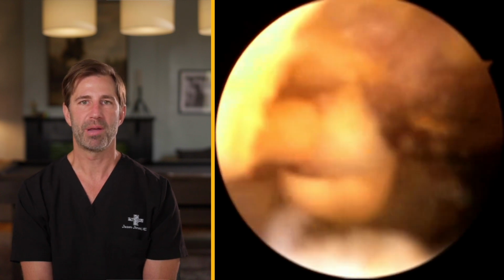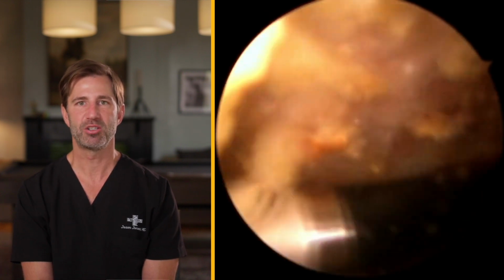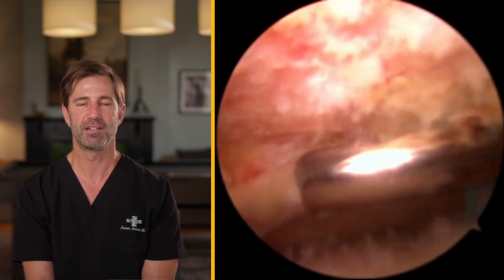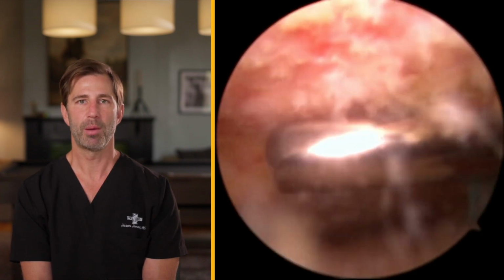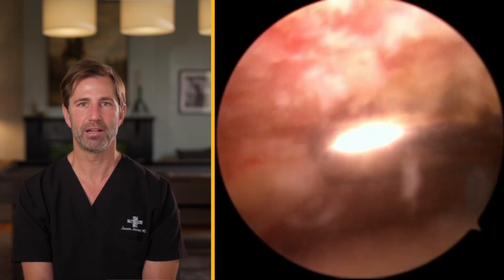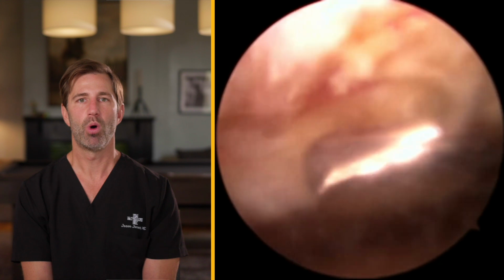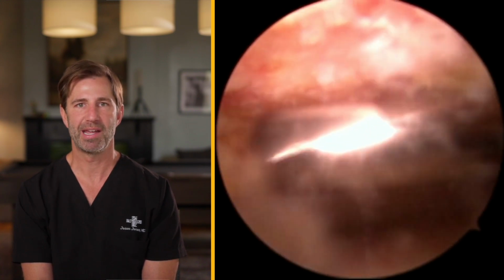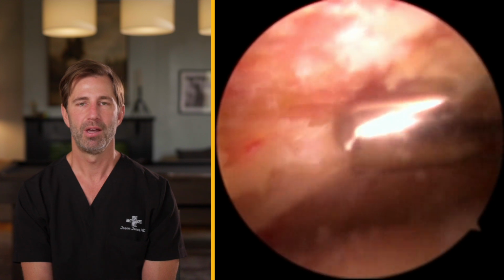One issue that patients have is chronic impingement, and what this means is that the rotator cuff tissue itself, which is the soft tendinous structure in the rotator cuff, rubs against the undersurface of the acromion and can lead to tearing and oftentimes pain. What we'll do here is remove the undersurface of the acromion to allow the patient to have more space for motion of his shoulder.